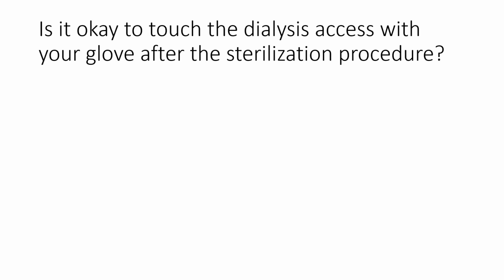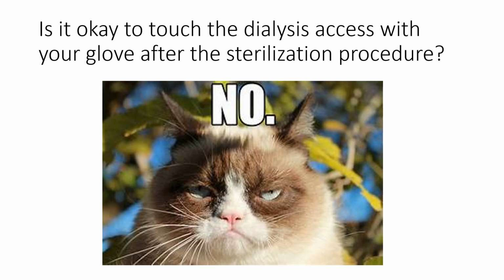Question number 2, is it okay to touch the dialysis access, say the fistula or graft, with your glove after the sterilization procedure? Of course, the answer is no. It's very tempting to touch that vein, but do not touch it. The gloves are not sterile and they can introduce bacteria back to the skin.